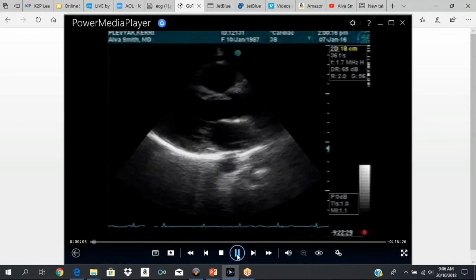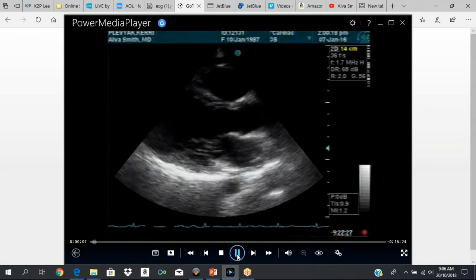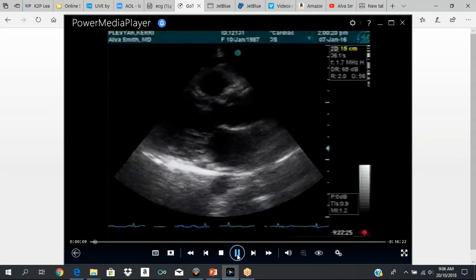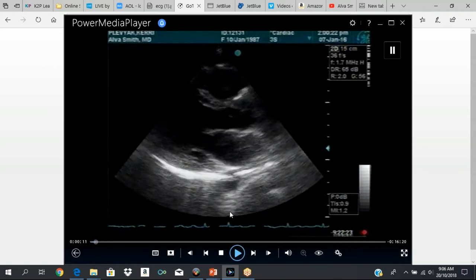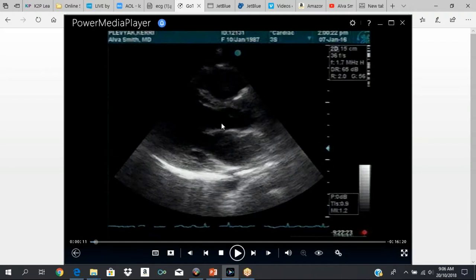You should get something looking like this. This is the parasternal long axis view. This is the posterior wall right here. Below the posterior wall, you have the pericardium. Pericardium is right there. This structure here is the descending aorta. Then we have the mitral valve, the mitral leaflet. This is the anterior mitral leaflet, and this is the posterior leaflet.